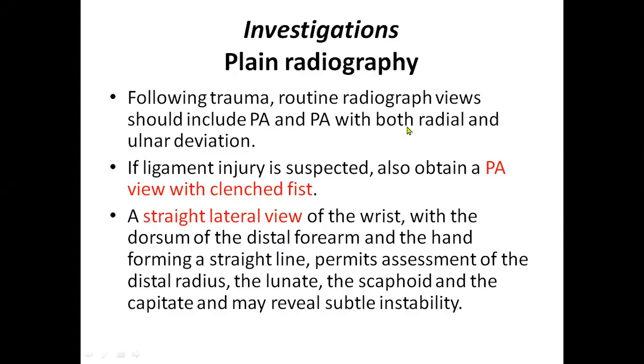So this is the third session of the wrist injuries in sports. In this session, we will discuss the different medical imaging: the MRI, and the different views on the X-ray, which can be used for assessing different fractures as well as different ligament tears.